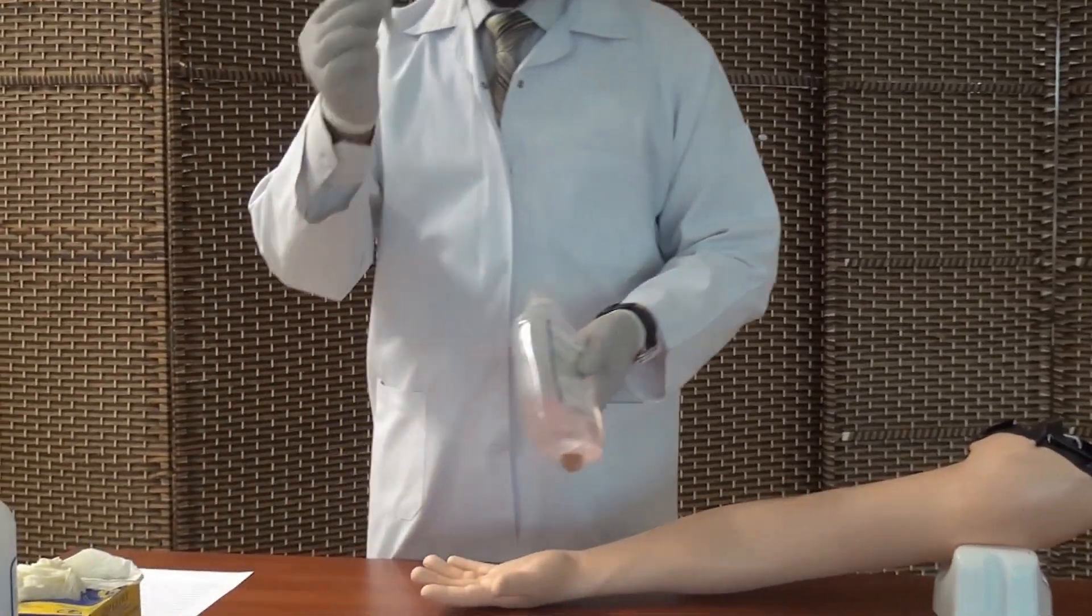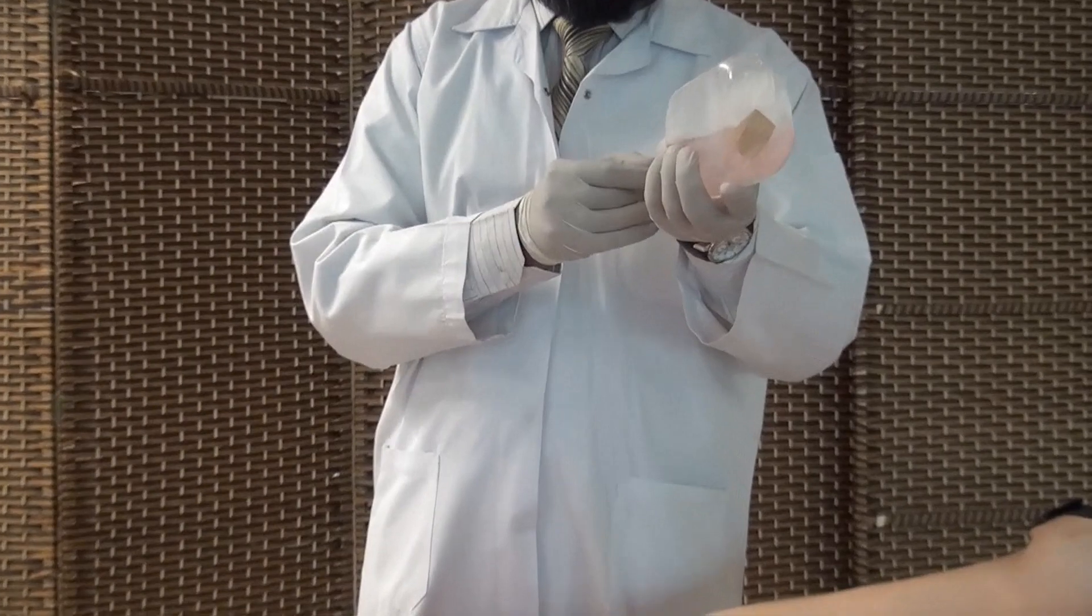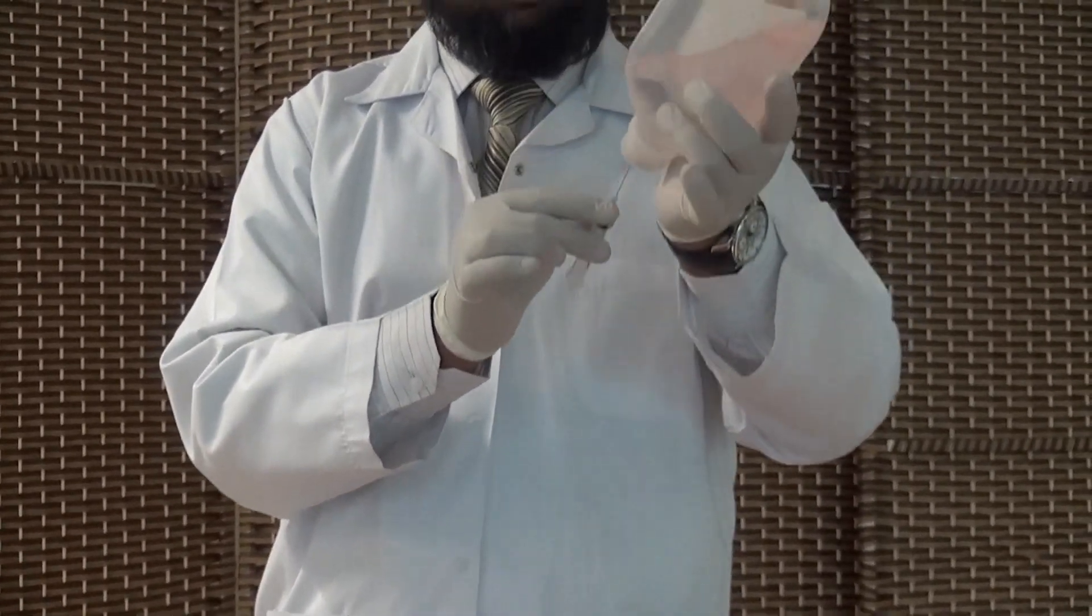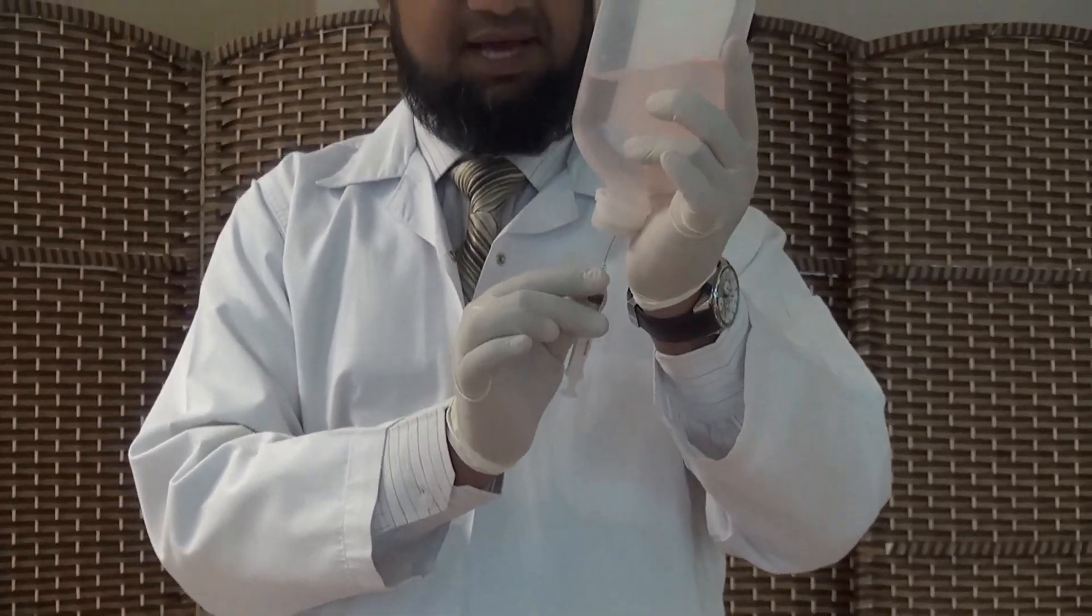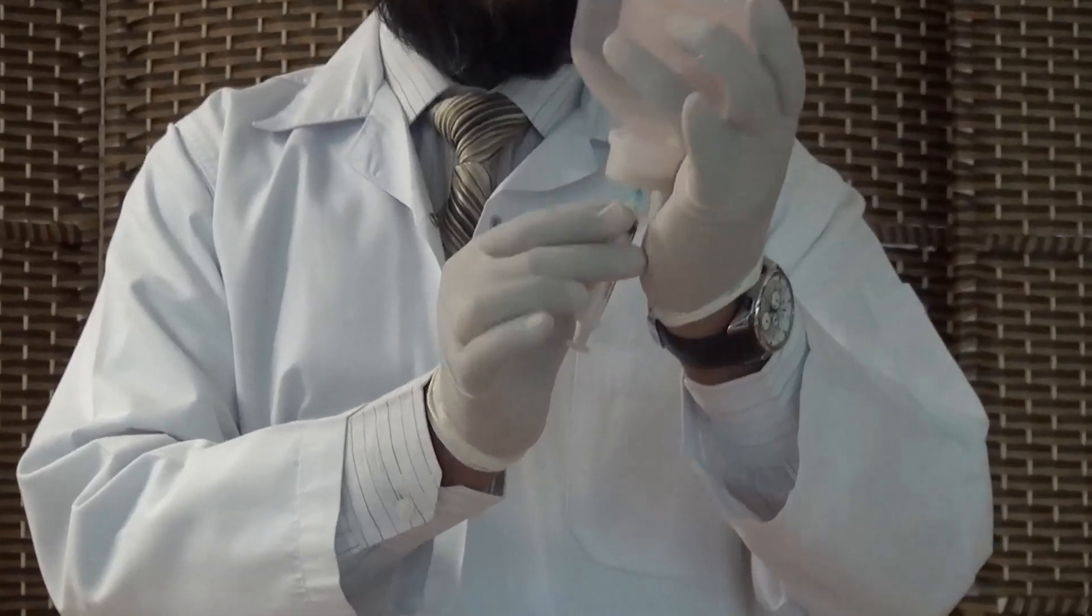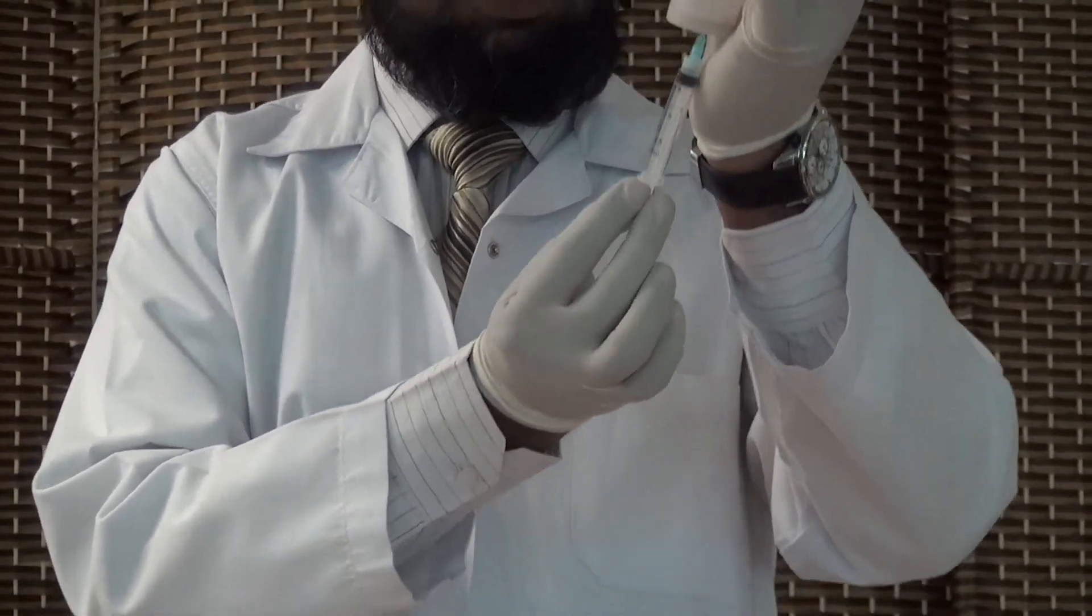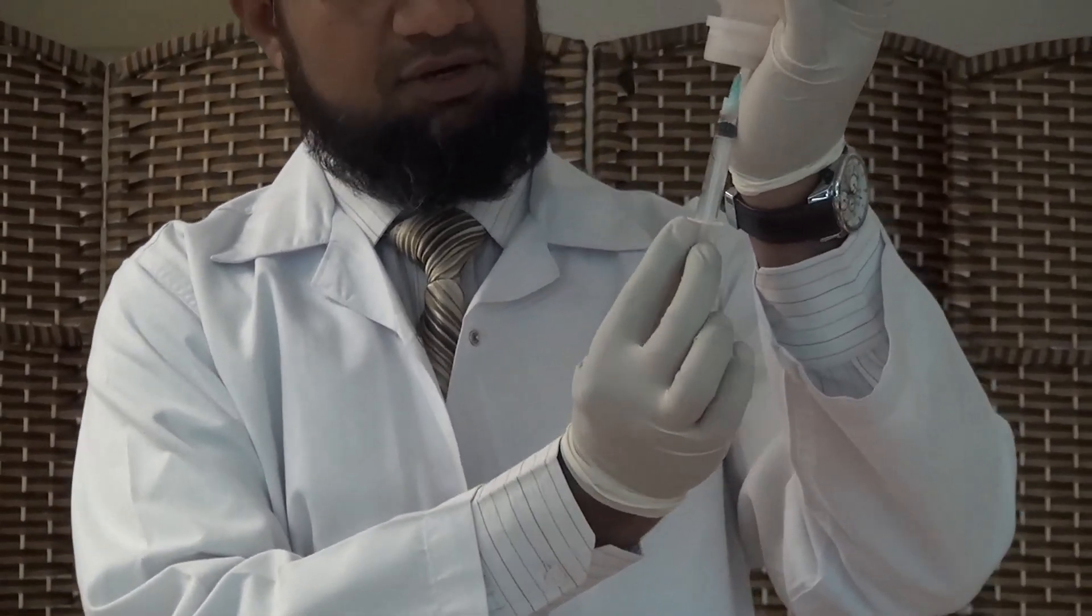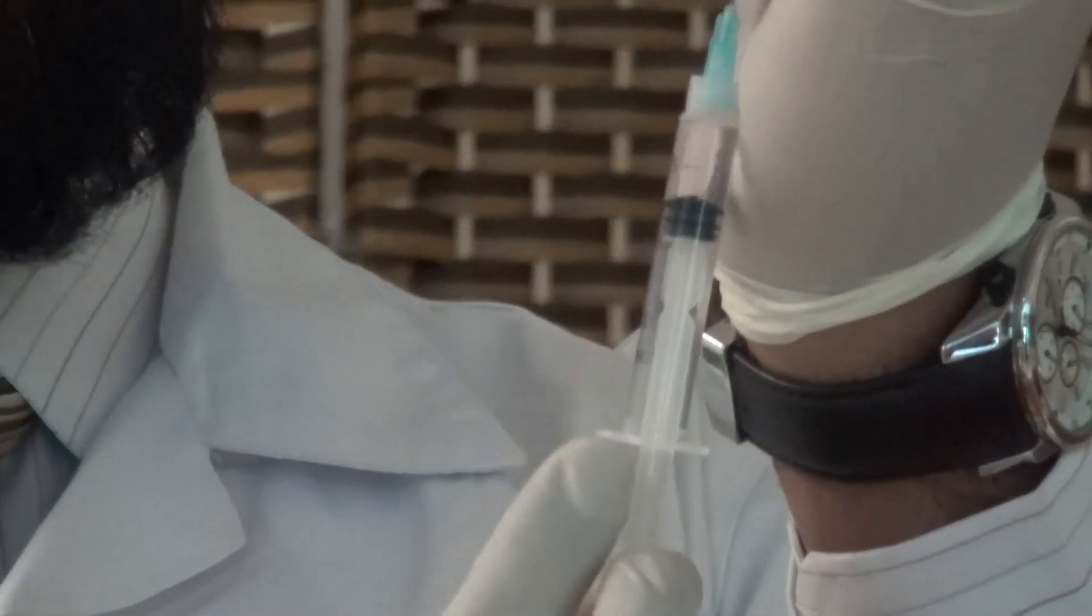So let me fill in one cc of normal saline. You always hold the medication vial like that or the bottle. Get into it carefully and draw one ml or one cc of normal saline. Now we are done.